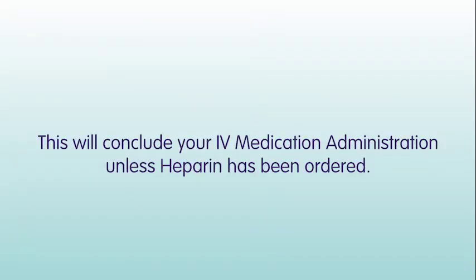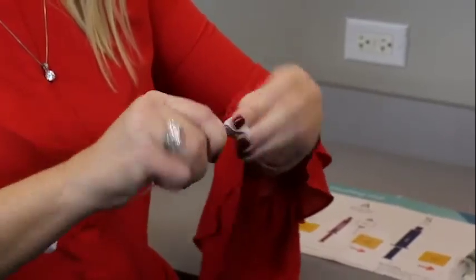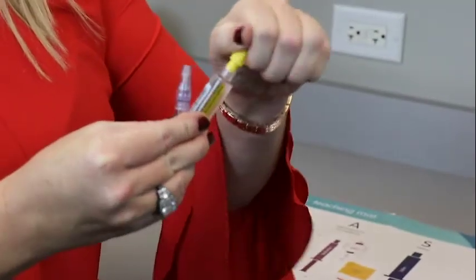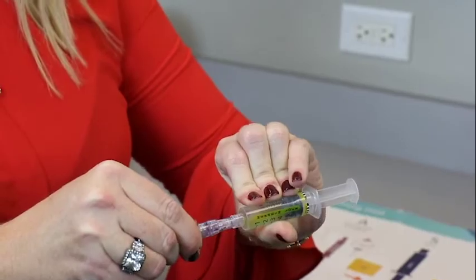This will conclude your IV medication administration unless heparin has been ordered. If ordered, you will need to flush your IV line with heparin. Scrub the needleless connector on your IV catheter with an alcohol wipe for at least 15 seconds and allow to air dry. Remove the protective cap from the heparin flush syringe. Attach the heparin flush syringe to the needleless connector on your IV catheter.